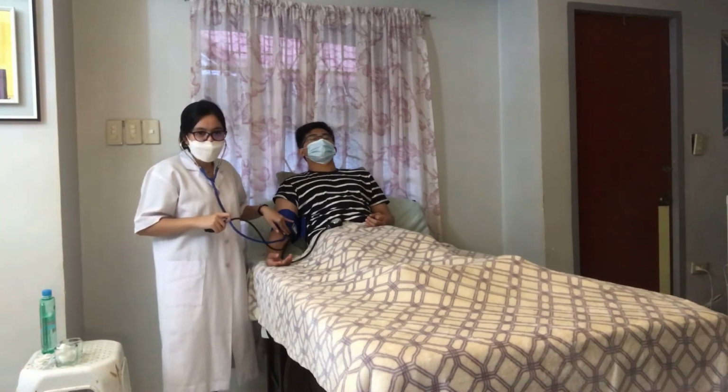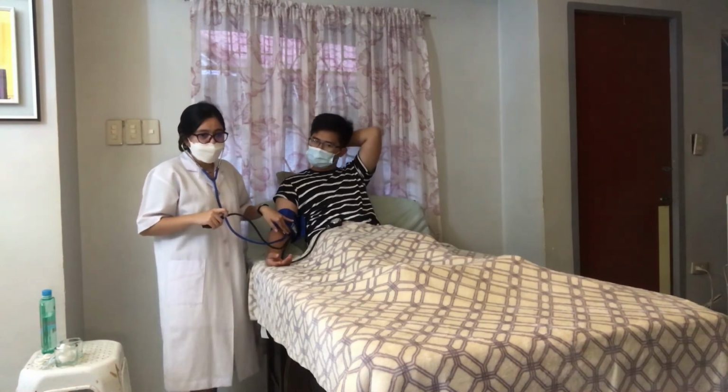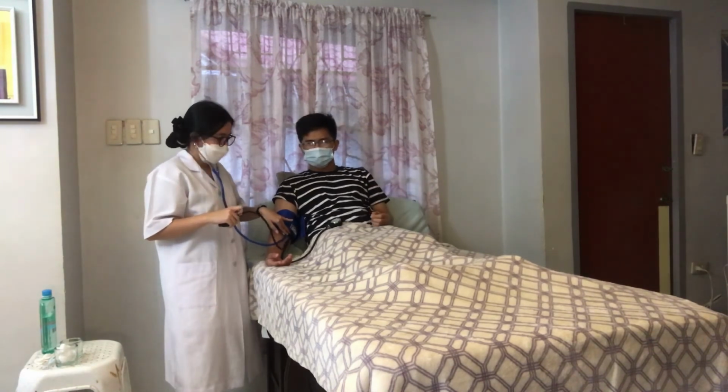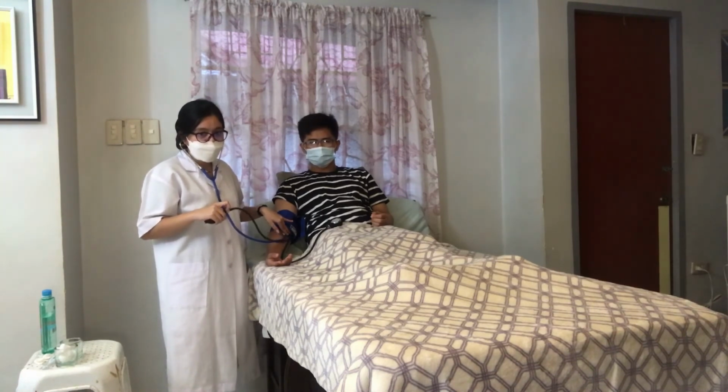Now after that, we are going to note the point on the manometer where the first clear sound is heard. The sound will slowly increase in intensity. And then we are going to continue to deflate the cuff, noting the point at which the sound disappears. So we must listen for 10 to 20 mmHg after the last sound, then allow the remaining air to escape quickly.